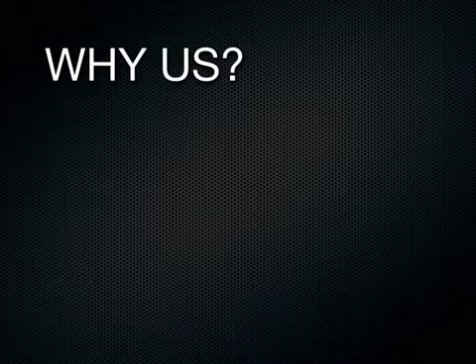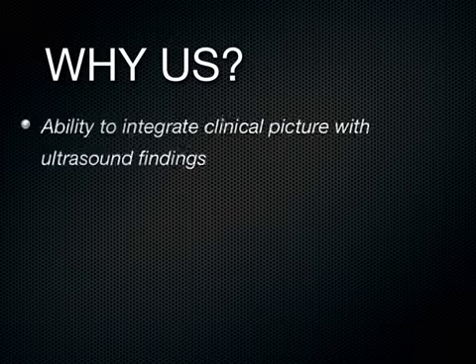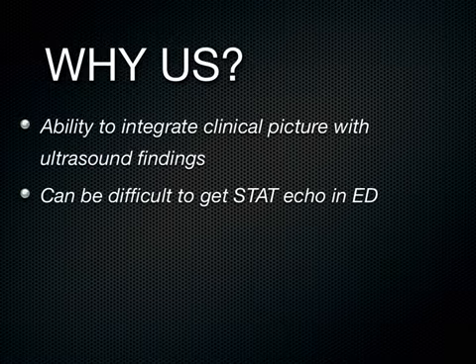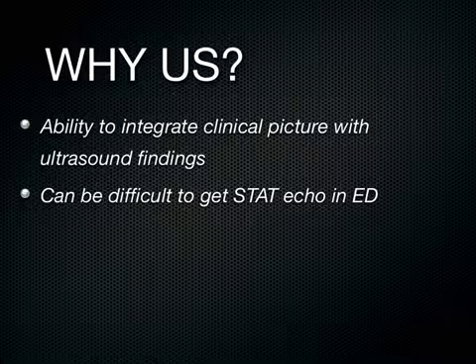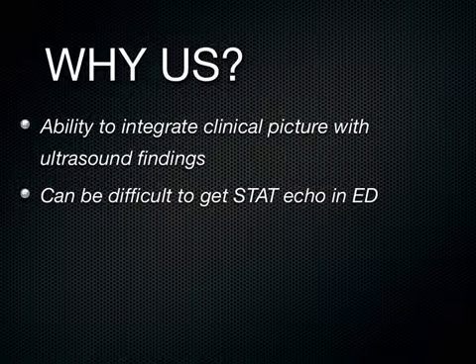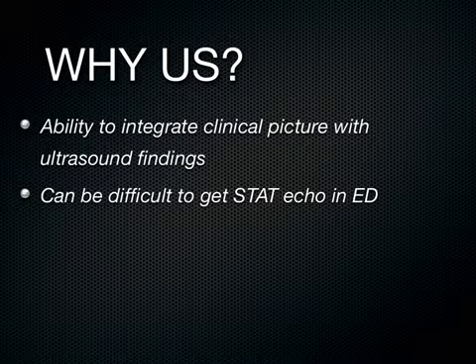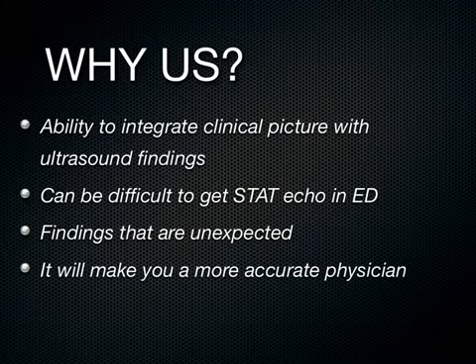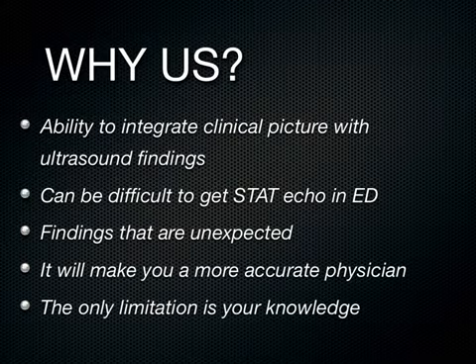So that's a good reason to think about why we should be doing cardiac ultrasound, because we have the ability right there to integrate the clinical picture with the ultrasound findings. We know sometimes it's difficult to get cardiology to come down and do a stat echo depending on the time of day. And by stat, maybe it gets done in 15 or 20 minutes. Stat for me means in the next 60 seconds. Also, in that patient, it was an unexpected finding. And I think all that makes you a more accurate physician, the only limitation being your knowledge.